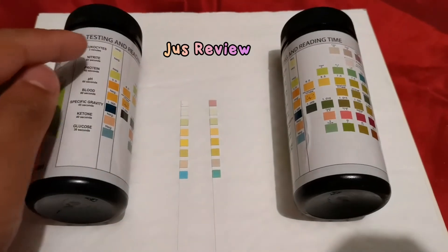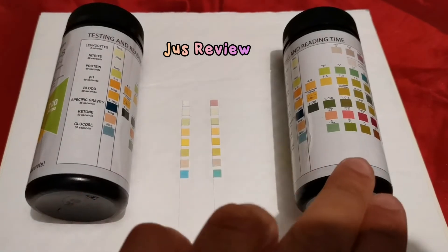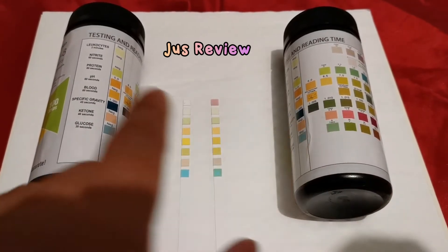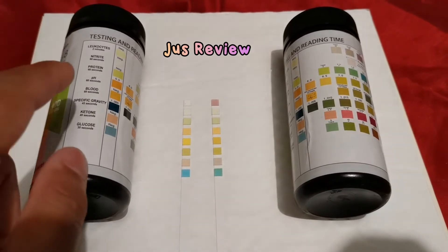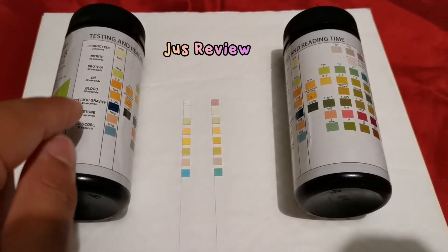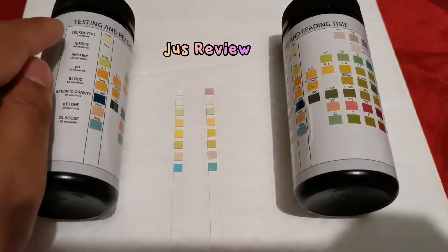As you can see on the left, there's a chart of eight different tests that both of these urine test strips perform. They're both the exact same brand — the only difference is the duration I've had them. The ones on the left I've had for less than a week; the ones on the right I've had for more than a month.